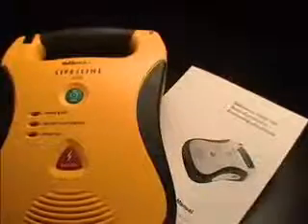Stop motion. The unit will not analyze the victim's heart rhythm if it detects the victim is being moved. Stop motion and do not touch the victim if so instructed. For a complete discussion about the Lifeline AED, its voice prompts, and other related information, please carefully review the user's manual.